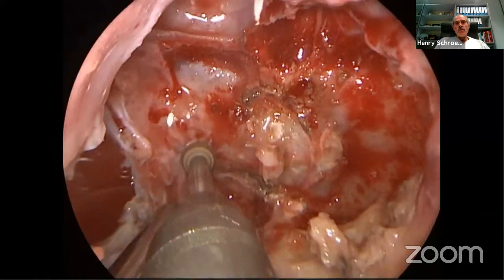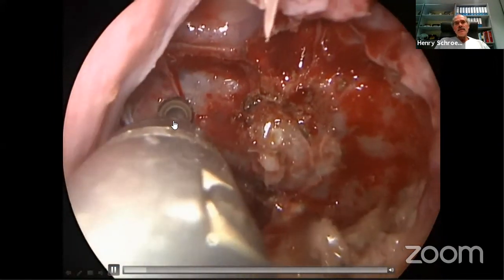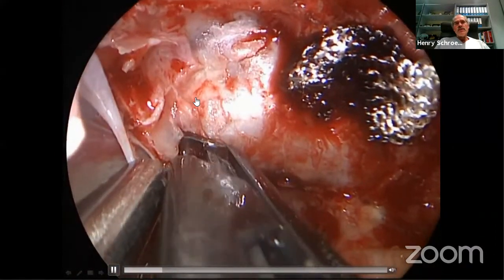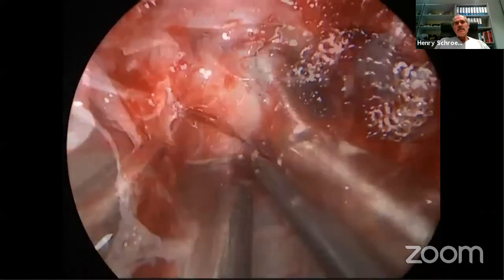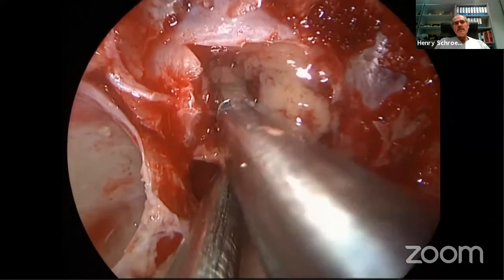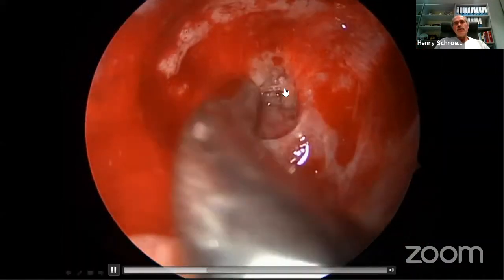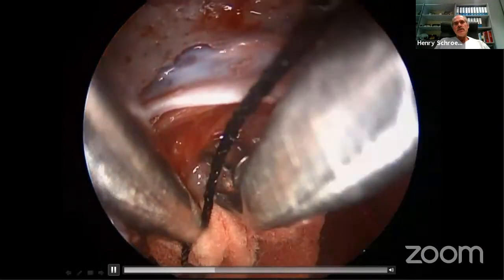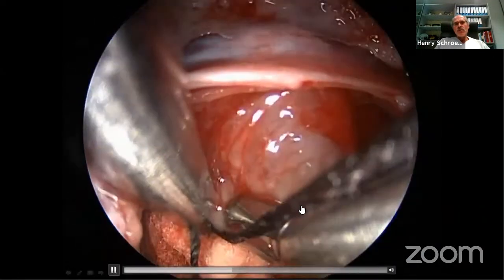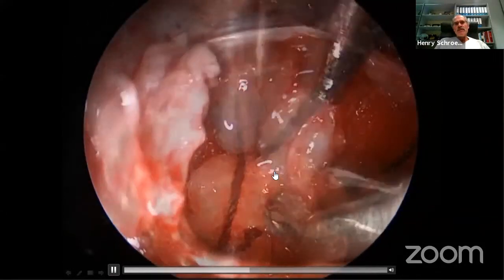So surgery was performed, and you see the bone here is very thin. It's opened widely to the side. Then the dura is opened, and the tumor is resected. The tumor is going through the wall of the cavernous sinus around the carotid, which was seen. And then here is a very thin diaphragm. It's a small tumor residual on the diaphragm, but you see it's very thin.